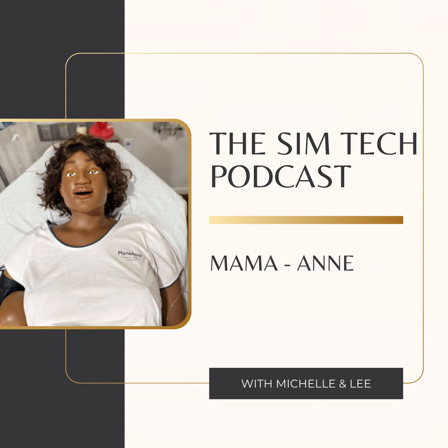So, you know, you make difficult airway, those kind of things. Yeah, good question. Again, it's a simulator designed for OBS rather than trauma. A lot of people ask, why can't you just have a simulator that does absolutely everything? Because of the electronics and the switchboards inside them and the technology, to have everything in one simulator, it would need to be the size of a giant.